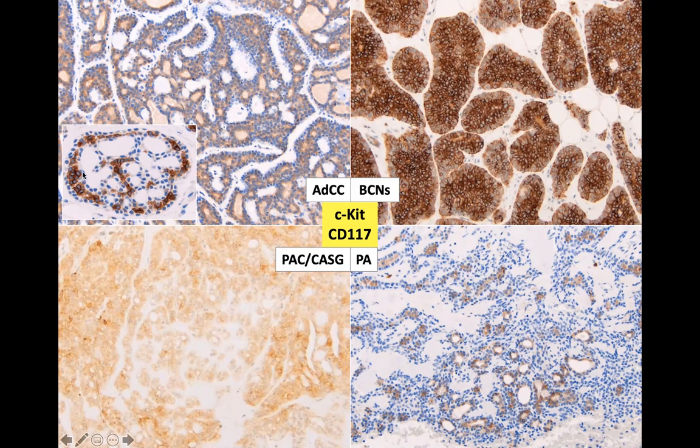negative. If you notice in the top left adenoid cystic, in the cribriform areas at least, the epithelial cells are essentially sandwiched between the myoepithelial cells, which are negative. The myoepithelial cells are the ones that produce that basement membrane material that either can appear bluish or pinkish. So this specific distribution is very helpful.